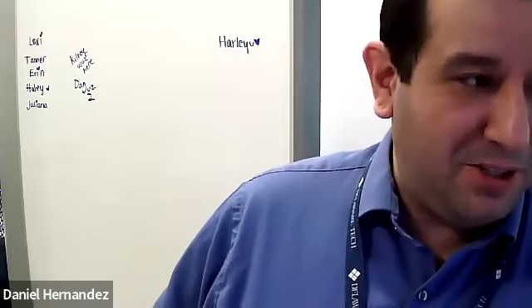I always like to tell, when I'm doing an appendix study, because you're not always going to find it, when you have the patient in the room and the mother or parent is nervous and worried about this, you just tell them it's almost like finding a needle in a haystack. We're talking about something that's positive when it's inflamed at 6 millimeters in diameter. So we're talking about half a centimeter in diameter if it's infected, and it's much smaller than that if it's normal. And we're looking for that within all your loops of bowel there. So it's challenging.